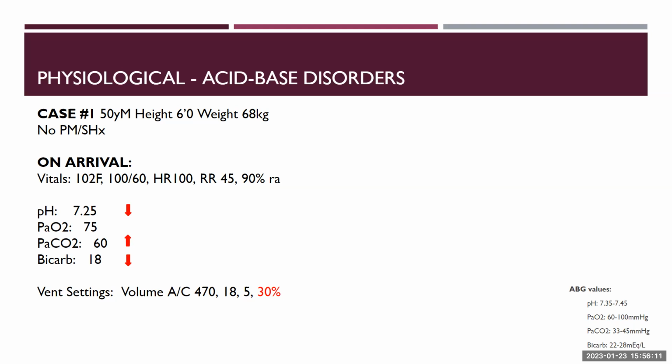What do you guys think is going on with this patient? Like matching the vitals with the actual pH, CO2. What do you think is going on? And we'll ignore the vent settings for now.